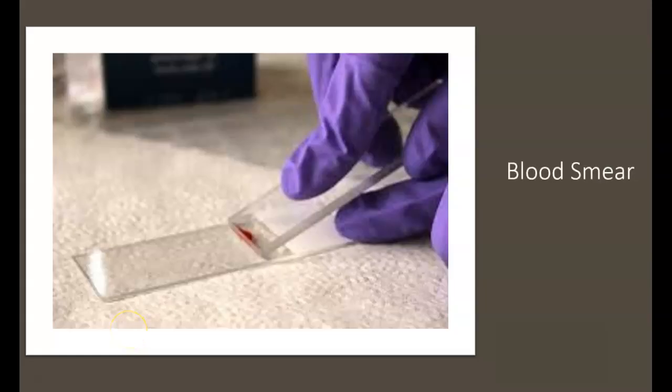When we talk about a blood smear, basically what that means is they take a drop of blood from a sample, so typically from a human, and then they smear that blood across the length of the slide. Really what we're trying to do is spread out all of the different types of blood cells that are going to be in that blood sample by smearing it all the way across the slide, and then it will dry out and we can look at it under the microscope.